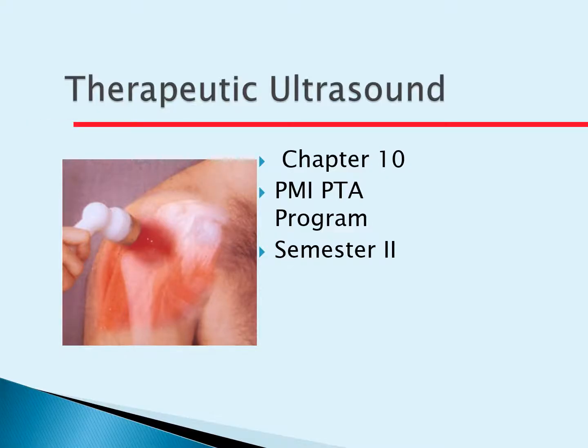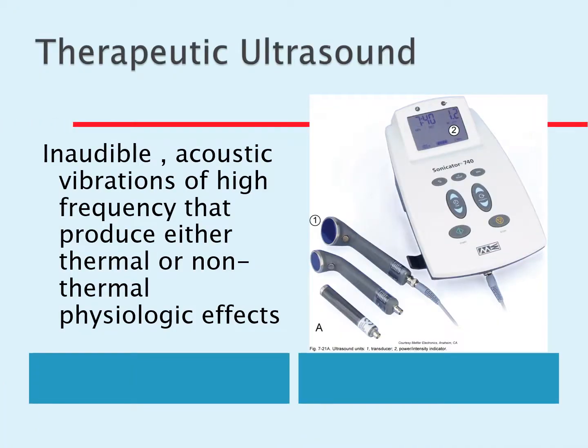This lecture is PTA103, Therapeutic Ultrasound Lecture for Semester 2 program. This lecture will be covering the various uses of ultrasound, the different types of ultrasound, and how it will be used in the clinic and will be used by PTAs to help treat patients with different conditions.